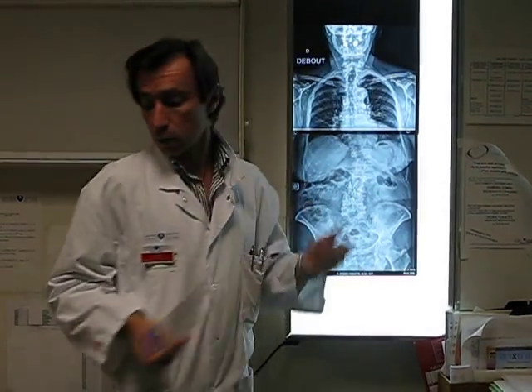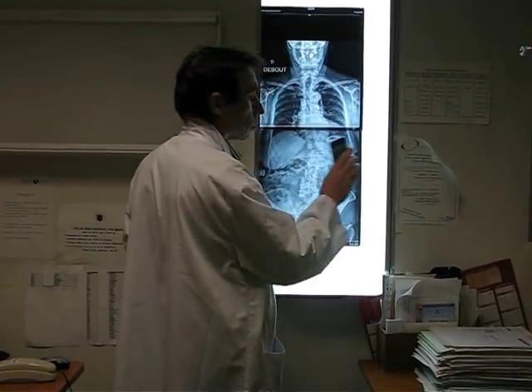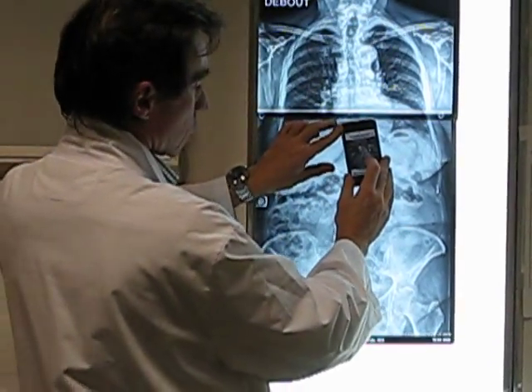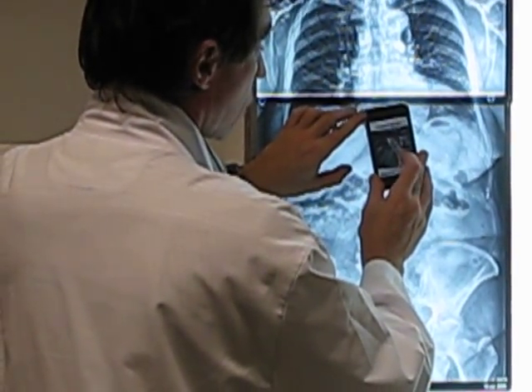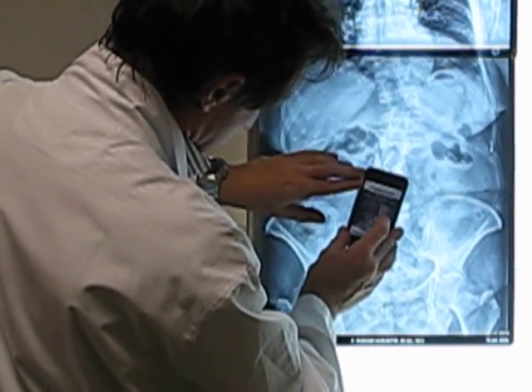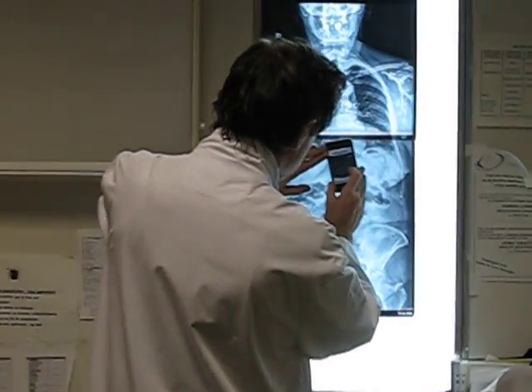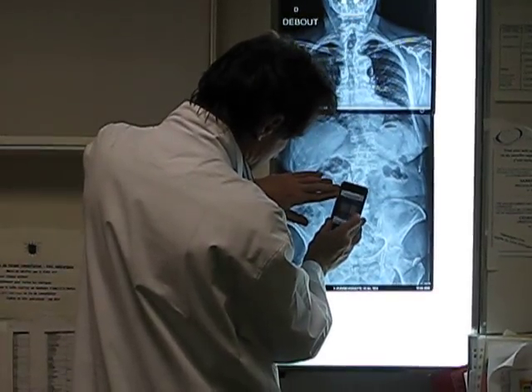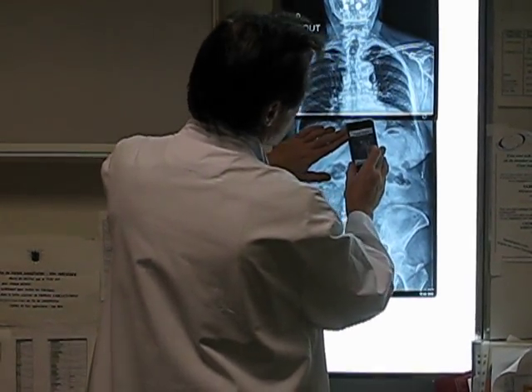So the purpose of this software is just to facilitate the measurement. What you do is run the software and align the upper edge of the iPhone with the upper end plate of the limit vertebra, and you just click on the screen as indicated. You can do it again, and here it is — 30 degrees. You have variability of about 1 to 2 degrees.